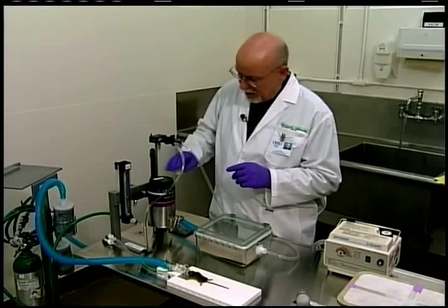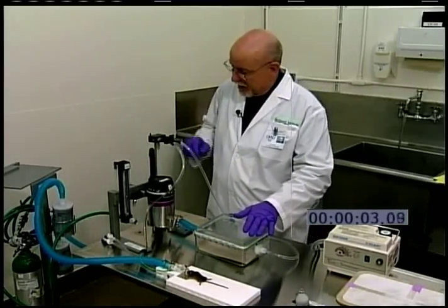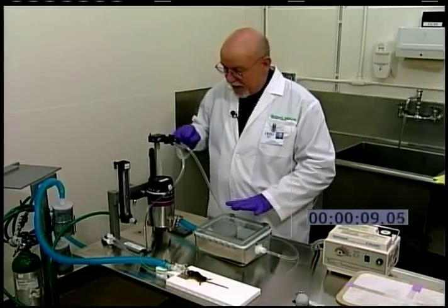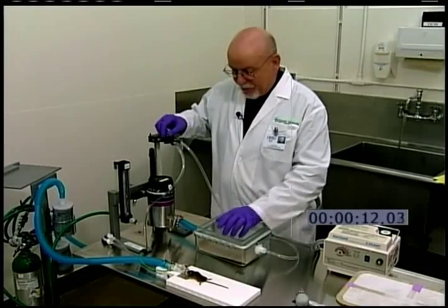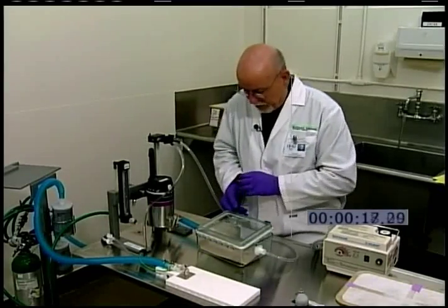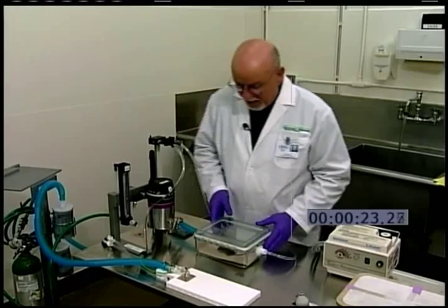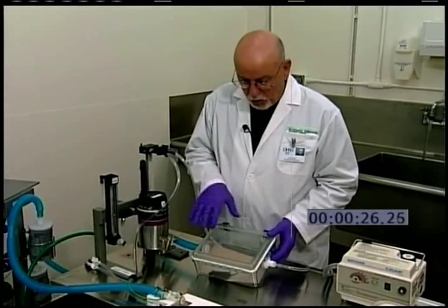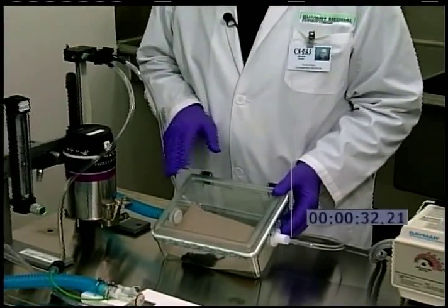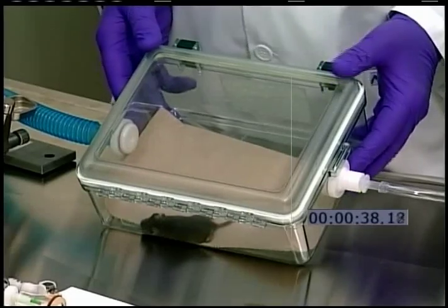So what I'm going to do now is turn off my vaporizer so that we're not administering any more inhalant anesthetic. I'm going to turn on the stopcock for the induction chamber. So now I have 100% oxygen going in there, and I'm going to turn off the non-rebreathing system. So I'll take my little friend and I'll put him into the induction chamber. Remember, we just have 100% oxygen in there right now. There might be some residual anesthetic in there that will allow him to breathe a slight amount of inhalant anesthetic. But we should see this little guy within approximately 2 minutes up and walking around in the cage.